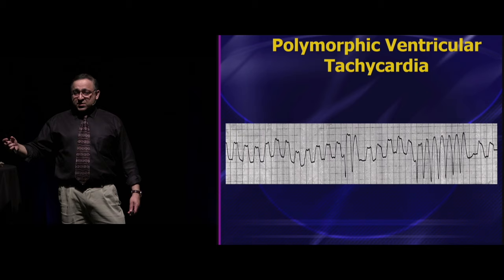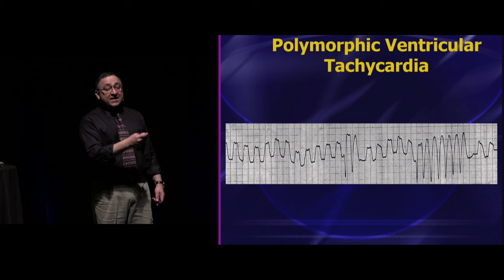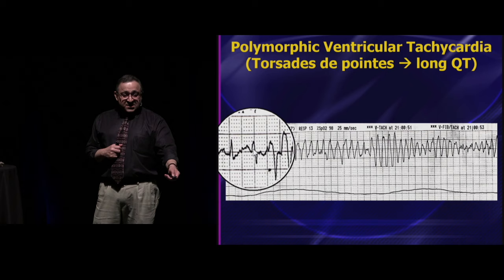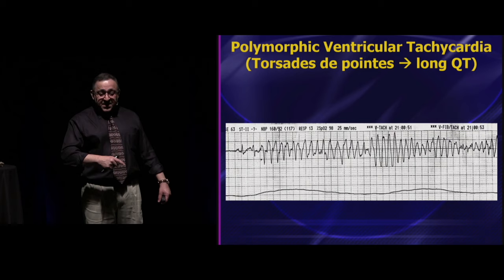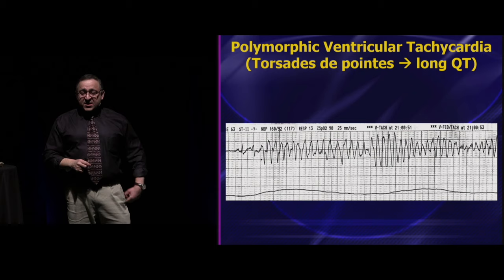Prolonged QT. All right? If you happen to have an EKG right before they went into the arrhythmia, you can look at the QT on that and know also, all right? So for example, here's a rhythm strip, and you'll notice just before the arrhythmia begins, there's a hint of a prolonged QT. This is torsade because of the prolonged QT, all right? Now sometimes people look at the rhythm strip here, and they say, well, the QRSs are bigger, smaller, so that must mean it's torsade. Wrong. All right? You cannot call it torsade just because bigger, smaller, because generic run-of-the-mill polymorphic VTAC does that also.